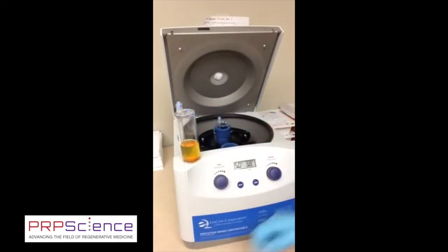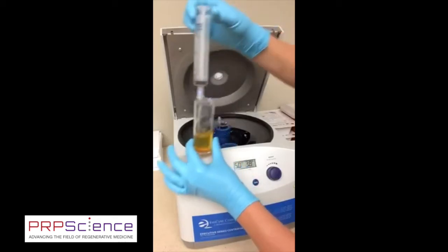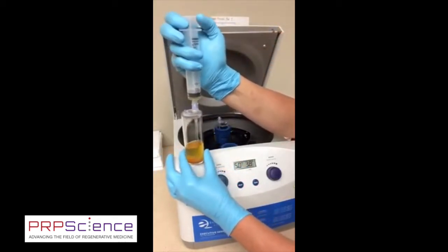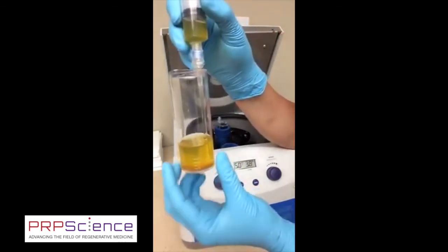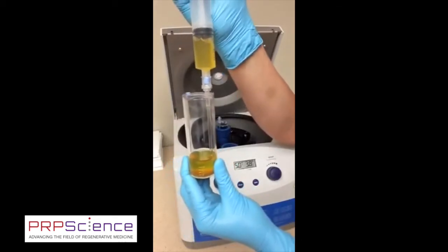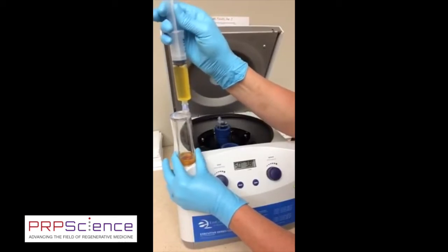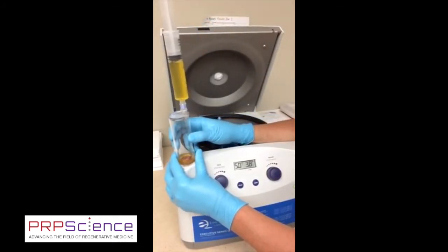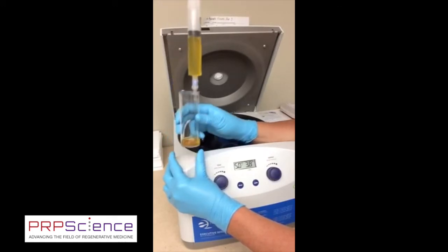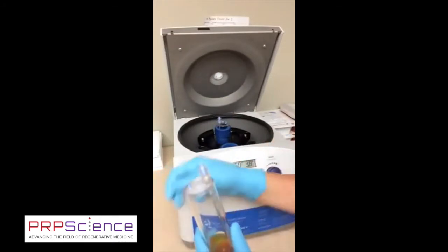So what we're going to do is take a 30 to 60 ml syringe. You have both in your kit. And we're going to remove the platelet-poor plasma. And you can see right here on the side gives me an idea of how much will be left here in the separator tube. Depending upon what procedure I'm doing, I want to leave 10 mLs in there or 7 mLs in there. And we're looking at 4 to 6 times baseline when we come up with 10 mLs of platelet-rich plasma. Okay, so this platelet-poor plasma I'm just going to dispose of.